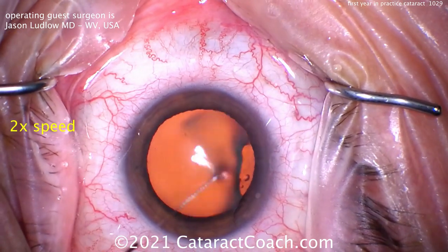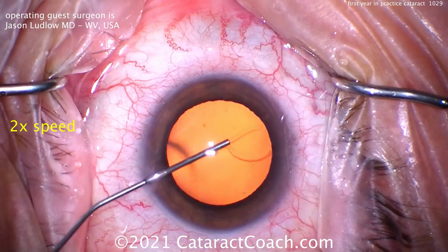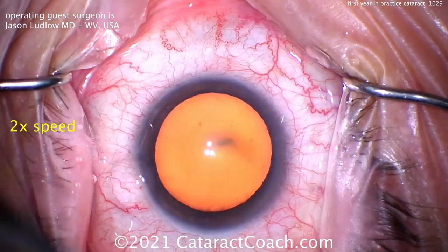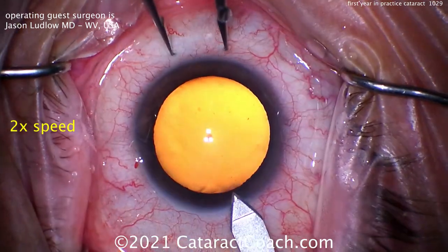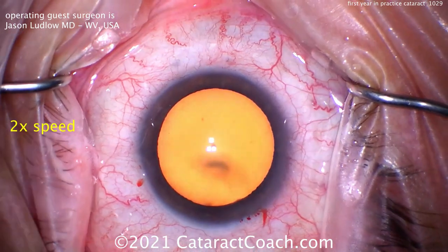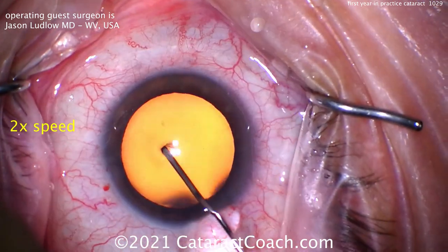Looks like a paracentesis, injecting anesthetic inside the eye and on the cornea. In that red reflex, you can see there's a posterior vitreous detachment. Good placement of dispersive viscoelastic — a nice wave coating the endothelium. Now fixating the eye with the 0.12 forceps, nice looking incision. Good tunnel length, good architecture. I like how the incisions are barely nicking the limbal vessels. That looks great.